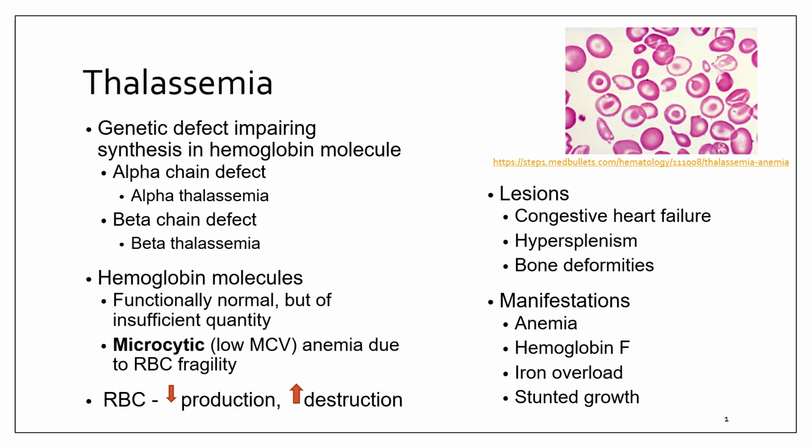Some worthless but fun knowledge is the name thalassemia comes from the Greek word thalassa, meaning sea, because it was first recognized in people from Mediterranean regions. So yes, this disease is literally named after the ocean. Big histology takeaway on this slide, when you're looking at blood smears, microcytic plus hypochromic does not always mean iron deficiency. Target cells plus very low MCV plus lots of variation equals think thalassemia. Your microscope will often tell you more than the lab values alone.